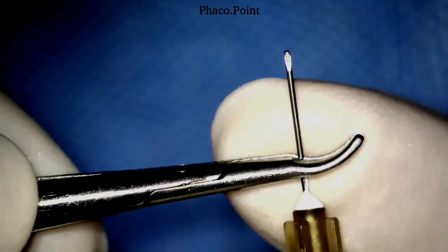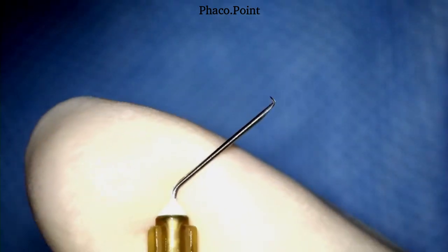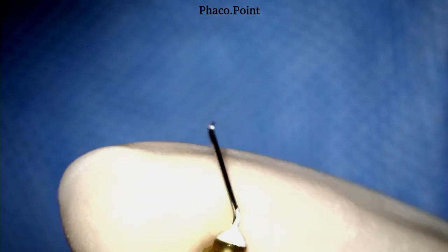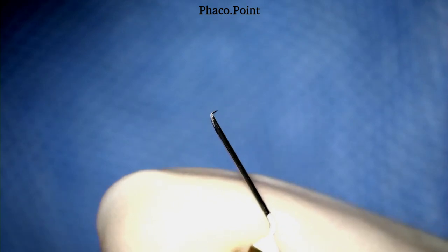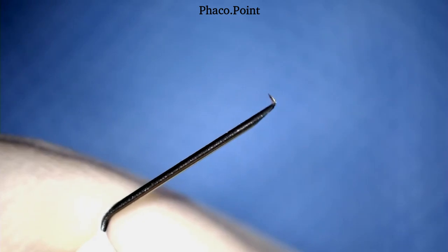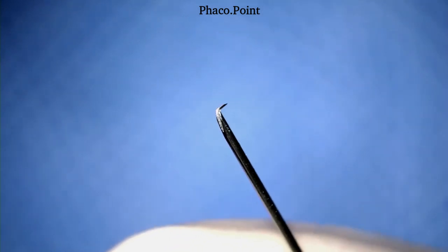It is turned in such a manner so as to create an angle of about 110 or 120 degrees. The cystitome thus created is what I would consider a perfect cystitome, wherein one-third of the bevel is bent to create the 90-degree bend and the tip is absolutely sharp.